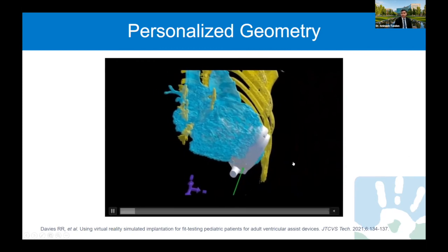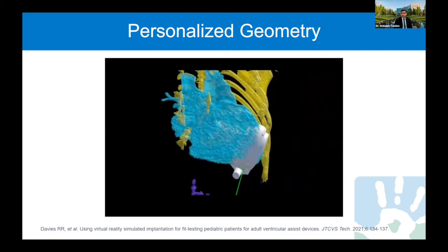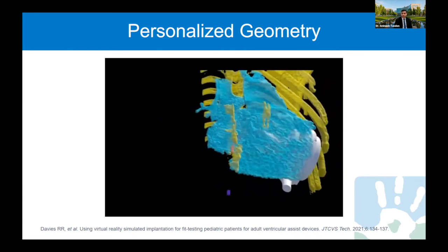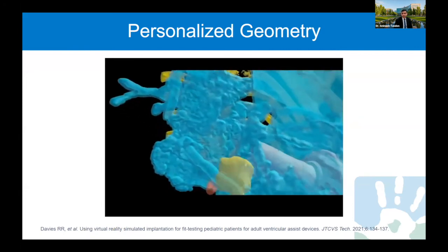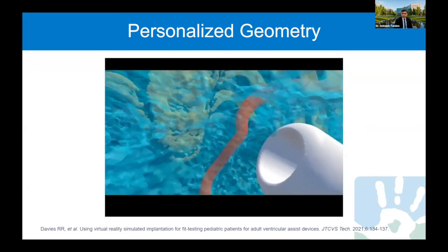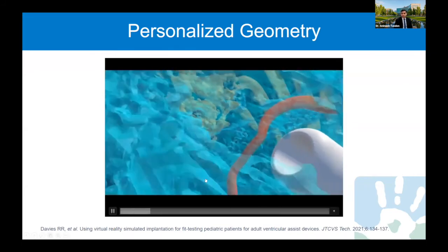And in this series, we presented 3 images of similar sized children, BSA 0.67, 0.66, and 0.65. And we evaluated whether the HeartMate 3 VAD would fit in the rib cage while being at least 1 centimeter away from the plane of the AV valve. And despite being heavier than the other 2 patients, the first patient had the shortest distance from the AV valve to the chest wall. We didn't proceed with the HeartMate.